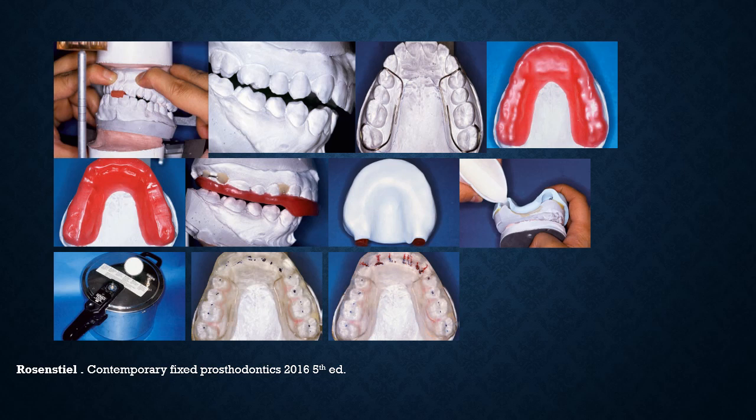After complete polymerization, reseat the appliance on the maxillary cast and do the necessary adjustment.